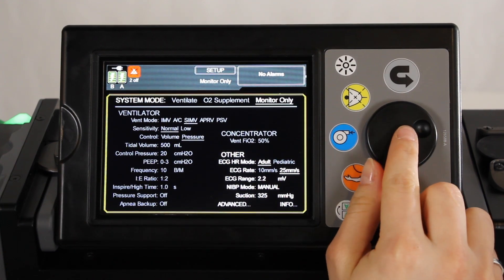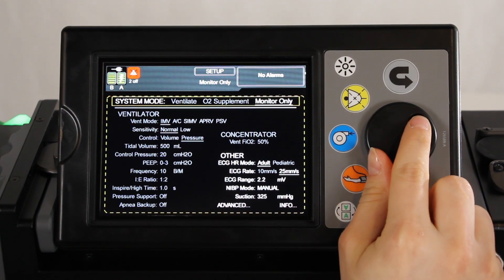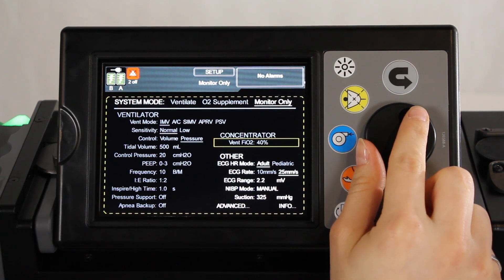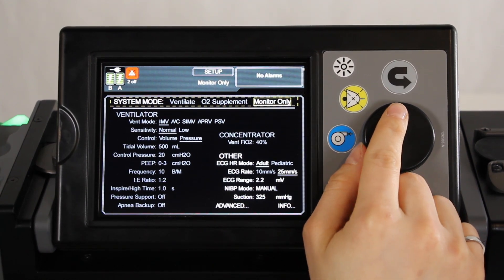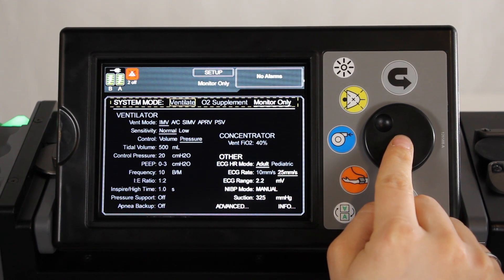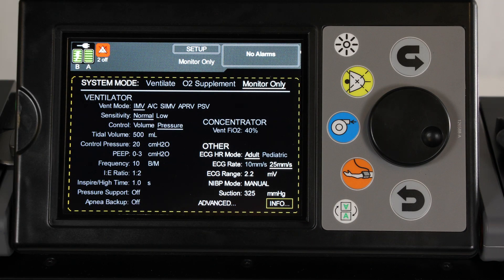If a different system mode is desired, first use the jog wheel to select and configure the appropriate settings. Then navigate to the system mode area and press the jog wheel to activate the selection. Select and confirm the correct system mode, either ventilate or O2 supplement mode. Use the back button to exit the system mode area. Note that the system does not ventilate in monitor only or O2 supplement modes.